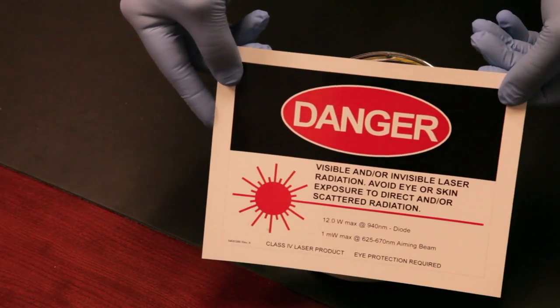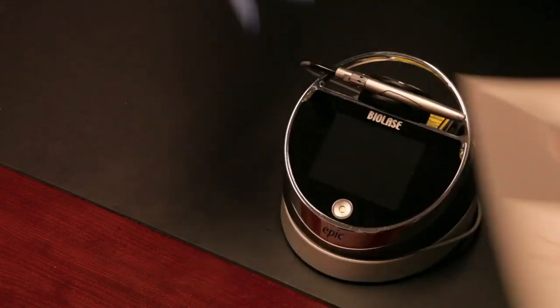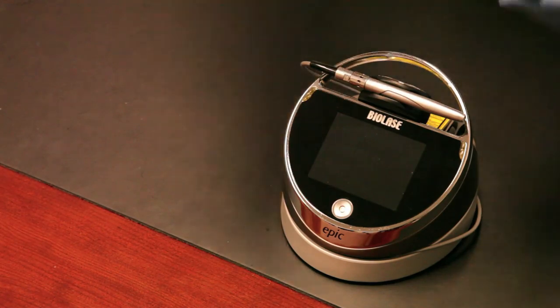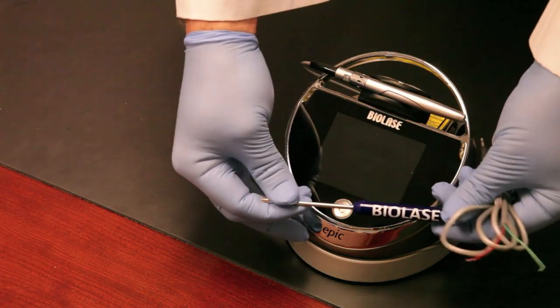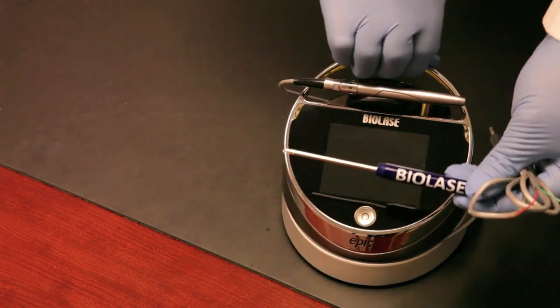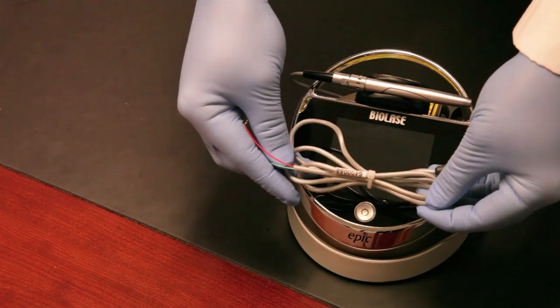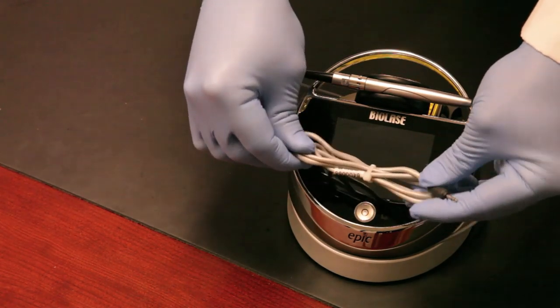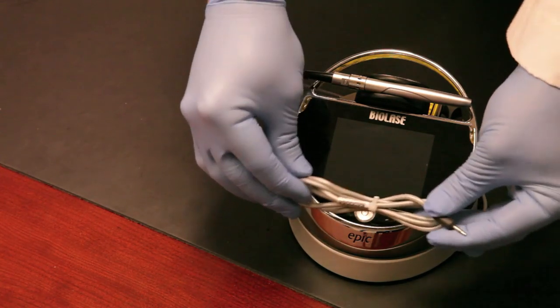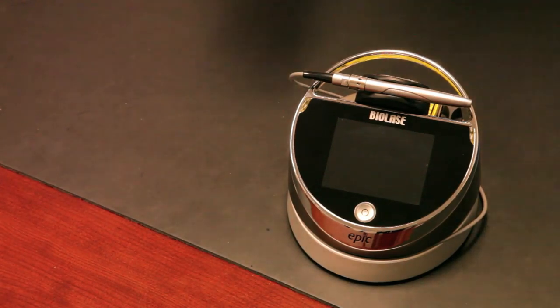There's also a laser danger sign for the operatory wall — you hang this where the laser is going to be used, and if you need more they're complimentary. There's a small screwdriver for installing the lithium-ion battery pack on the bottom of the laser, and a small gray cable called a remote interlock, which is basically a safety function — most people don't use it in the dental operatory.